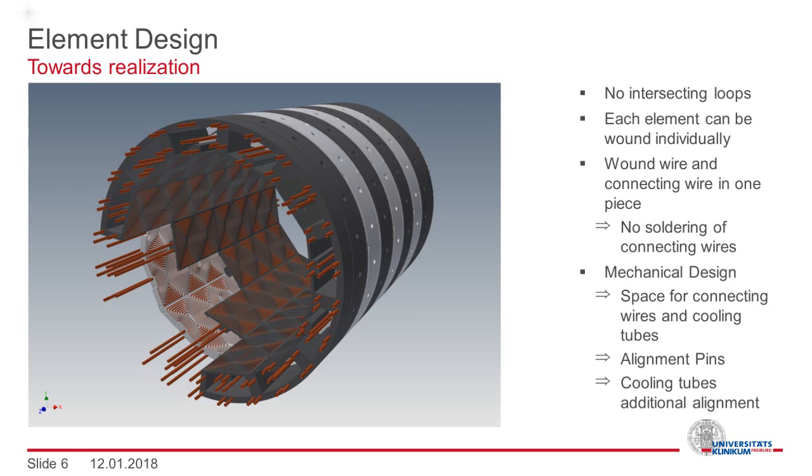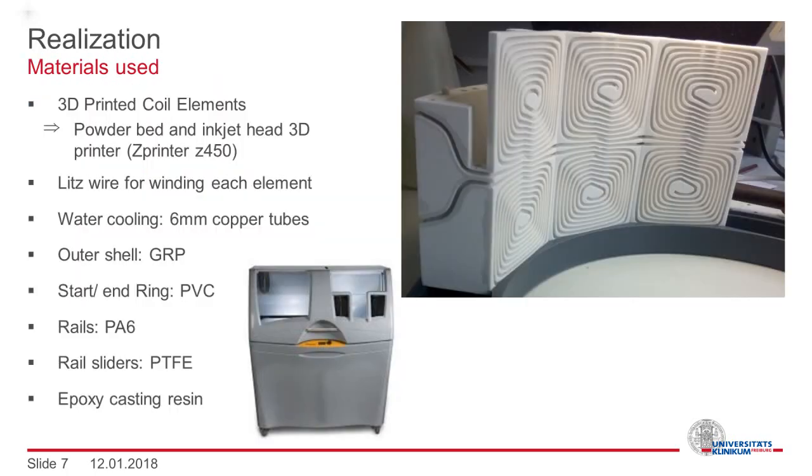Here you see a rendering to demonstrate how the final coil is going to look like. Each coil element was 3D printed using a powder bed and inkjet head printer based on a plaster material. We decided to use this technology because the resulting structure is porous and can be infused with epoxy. Additionally, it withstands higher temperatures than most plastic materials.